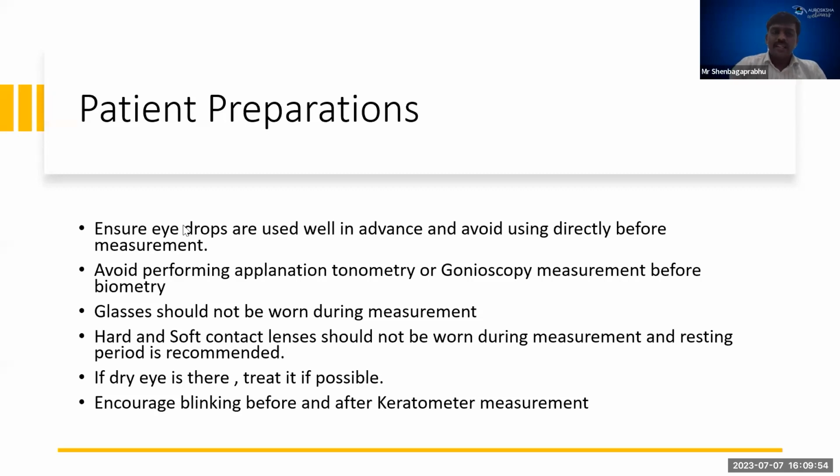If dry eye is there, we need to treat it if possible. We should always encourage the patient to blink before and after the keratometry instrument. Some patients are fast blinkers or very slow blinkers, so we can change our instructions according to the patient, because a well naturally lubricated cornea can give better mires, which is essential for good readings.